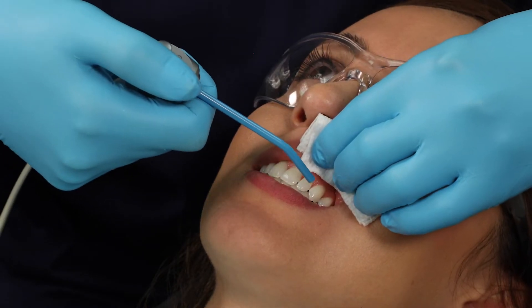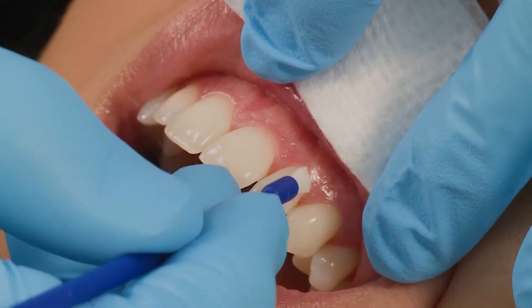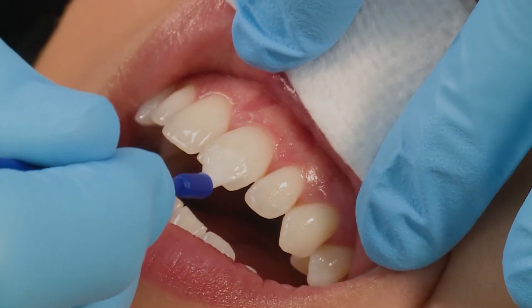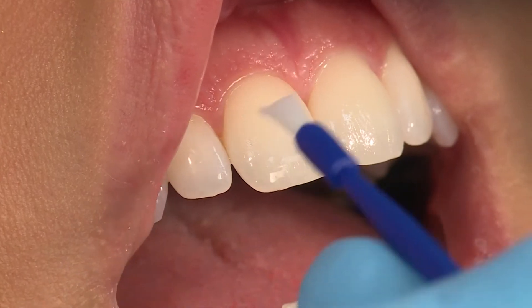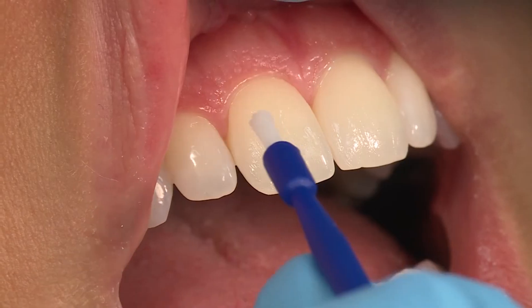Lightly dry the area to be treated. Using a painting motion, apply a thin, smooth layer of Enamel Last Varnish to as many dry surfaces as possible. Only a thin layer is needed. If too much varnish is applied or teeth are too wet, you may not get the smooth texture you are looking for.